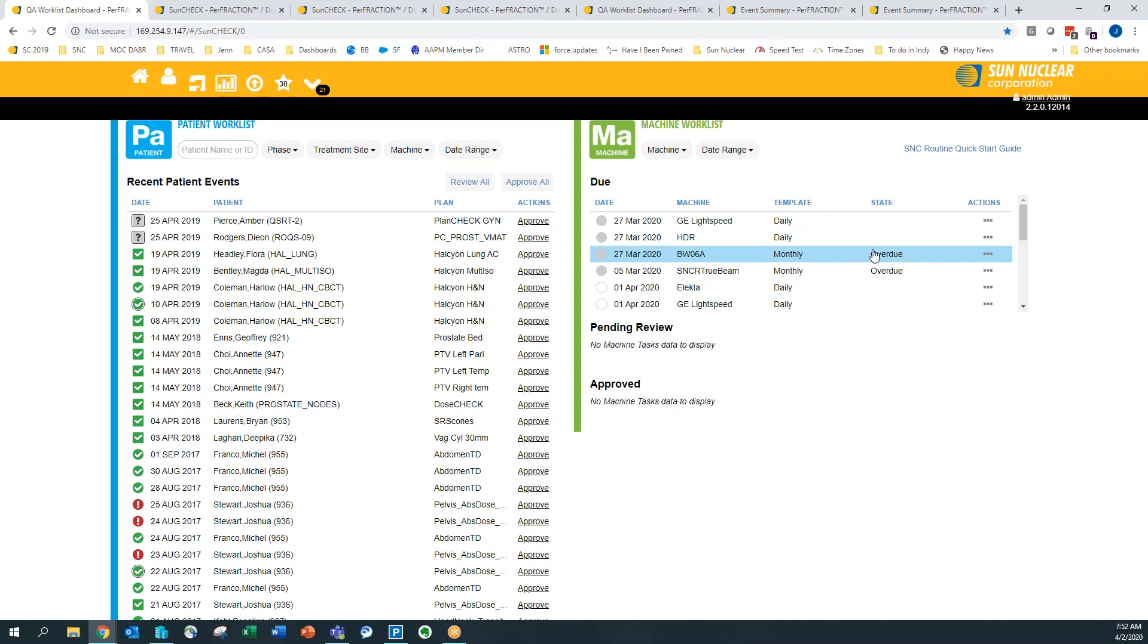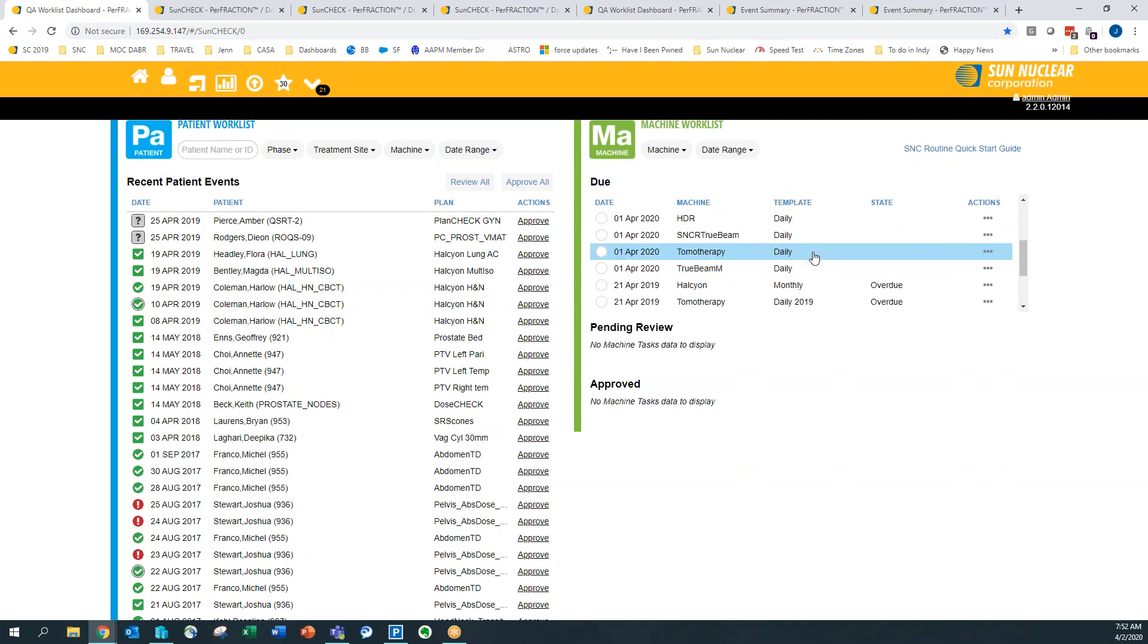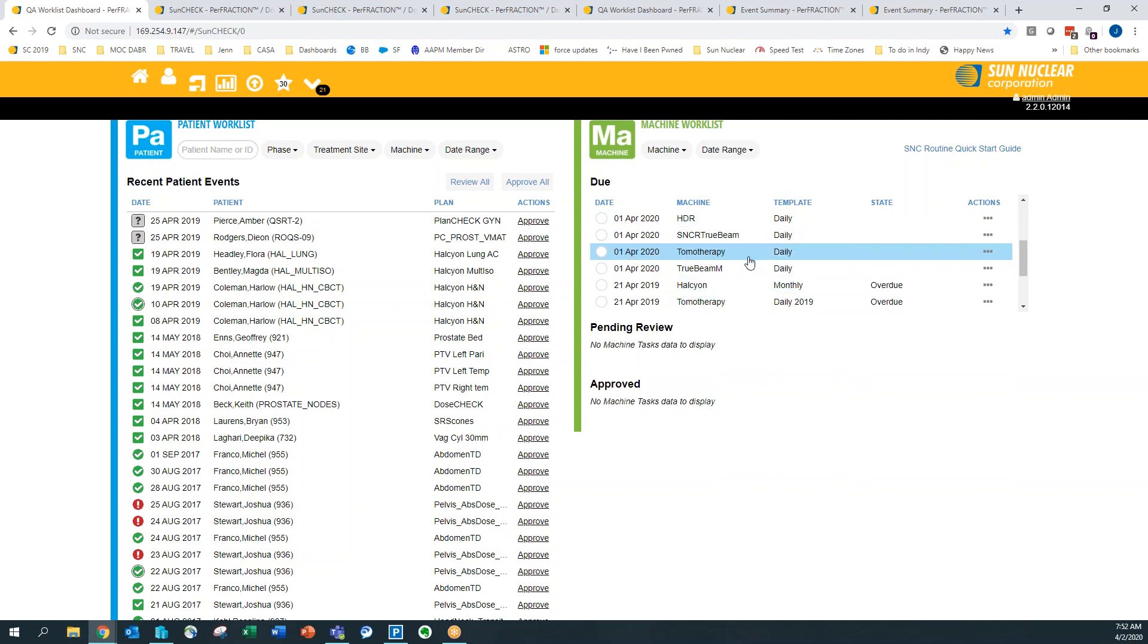And then for your HDR machines, for your CTSIM, for your CyberKnife, we do have dailies pre-programmed, also the tomotherapy for the dailies. We will be adding other dailies, monthlies, and annuals, but those are the ones we have at the moment.